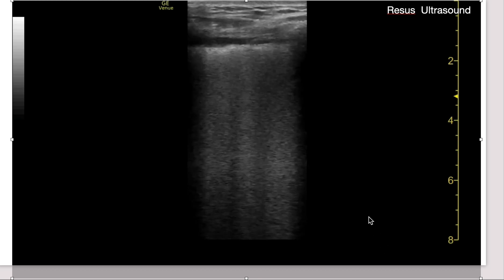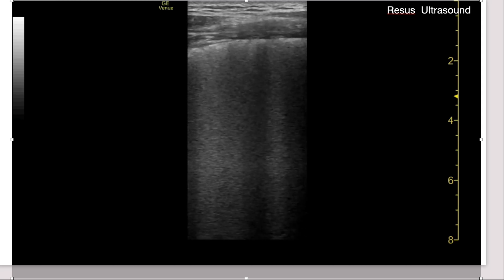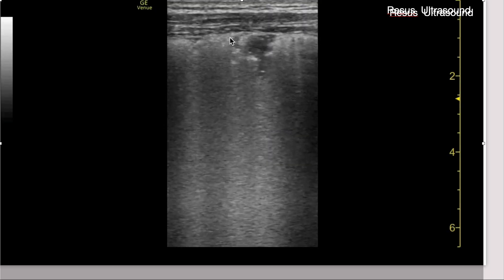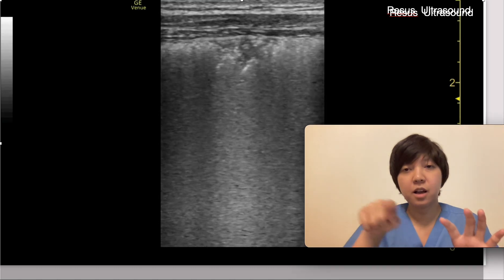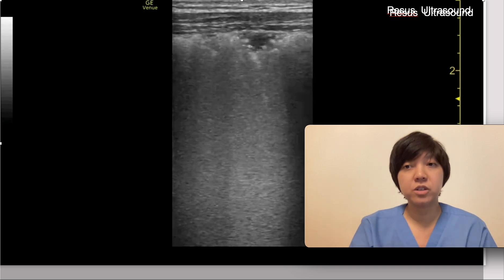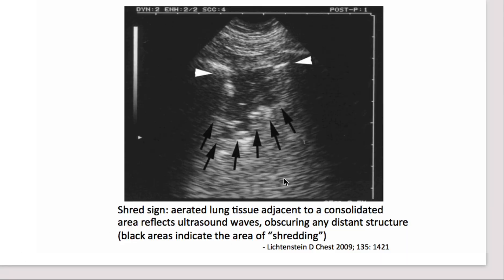This will help guide you that maybe this is not normal or typical heart failure — the pathology involves the pleura. When you scan more in this patient, voila — you can see consolidation. I reference Dr. Lichtenstein, father of lung ultrasound, who calls this the shred sign: aerated lung tissue adjacent to a consolidated area. This reflects that the surrounding tissue is no longer aerated and there is a lot of water around there.